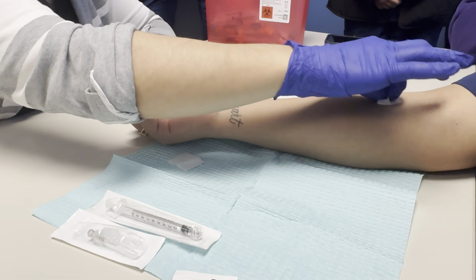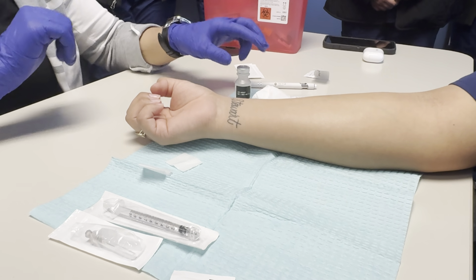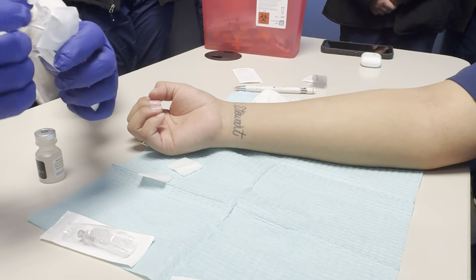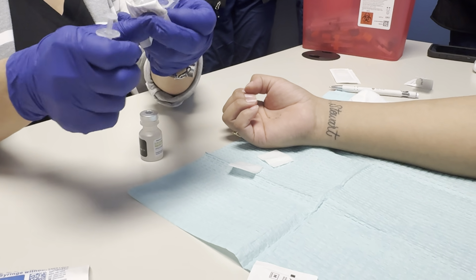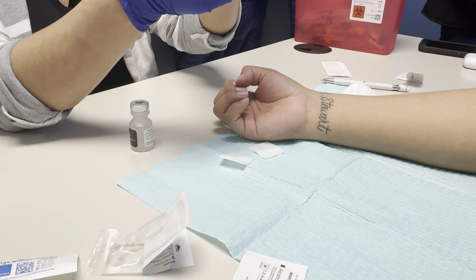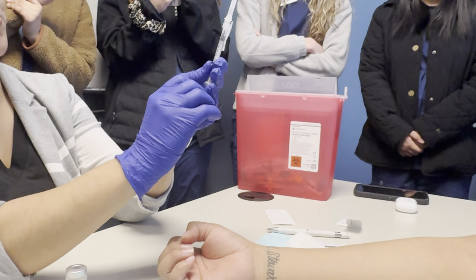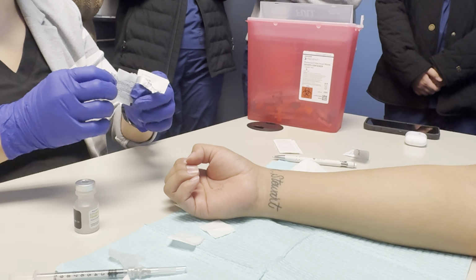I'm not going to blow on this. I'm not going to fan it. I'm not going to do anything. I'm just going to let that dry. While that's drying, remember, patients might not like to look at the needle. So I'm going to get my medication ready at my medication room, especially if it's a multi-dose, because I don't want it to get contaminated. So I'm going to move this. I'm going to bring my plunger back, easing it up a few times. And then my provider says 0.1, so I'm going to put in 0.1 air. And then I'm going to grab a new, brand new alcohol wipe.